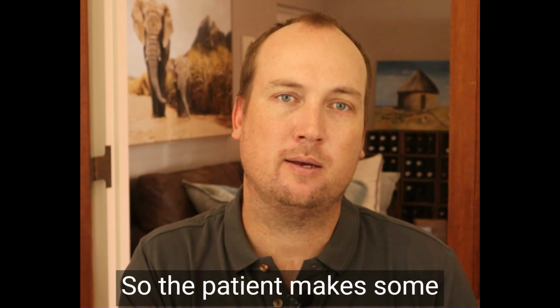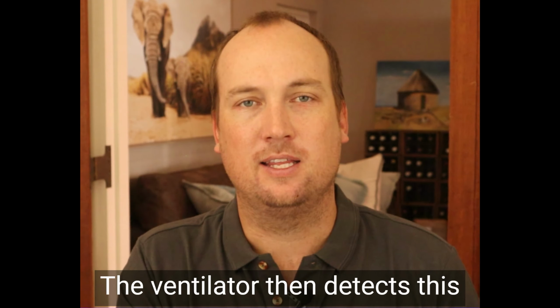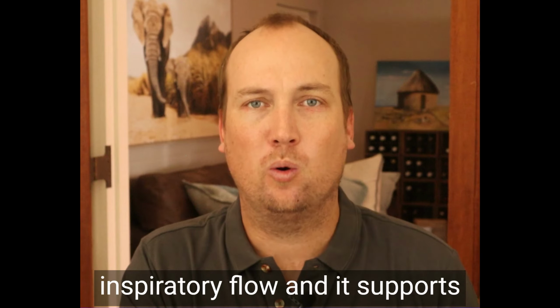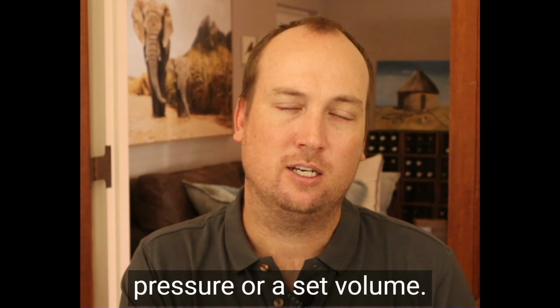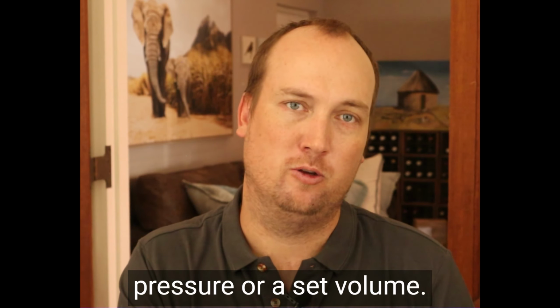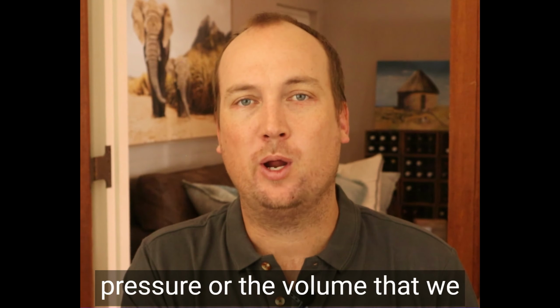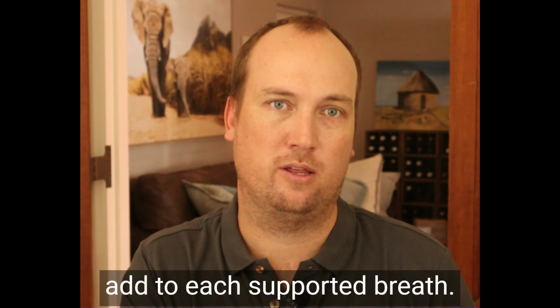So the patient makes some effort to suck air into their lungs. The ventilator then detects this inspiratory flow and it supports the breath with a set positive pressure or a set volume. The limit of the breath is the pressure or the volume that we add to each supported breath.